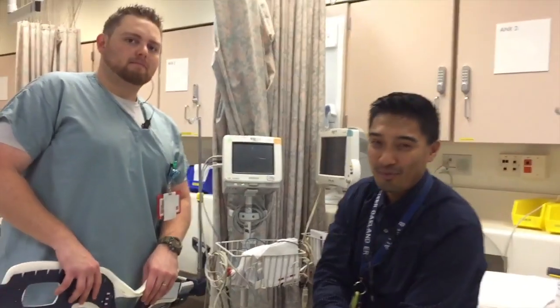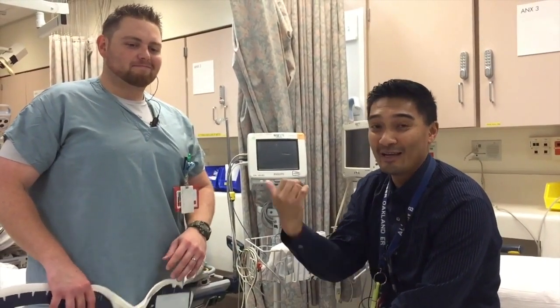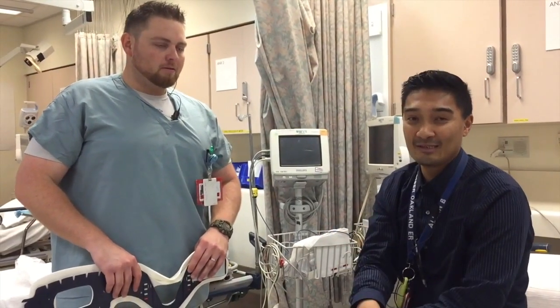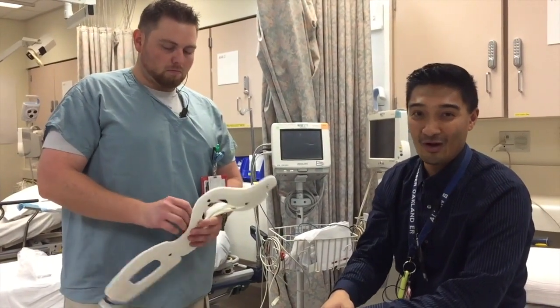Hey guys, this is Alan Bulda, Josh Burke, Kaiser Oakland Emergency Department and Kaiser Richmond Emergency Department. I also have Jake Behrens with us from Kaiser Richmond, and as part of our orientation series, he's going to demonstrate and discuss how to properly put on a cervical collar.